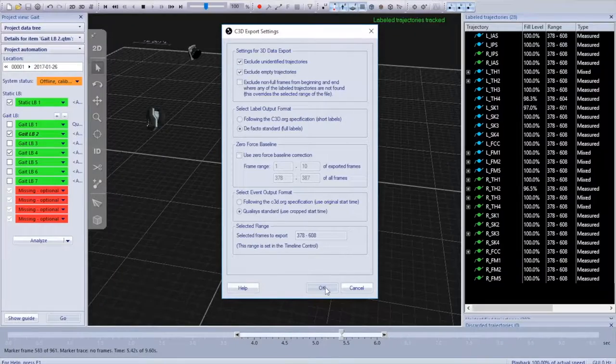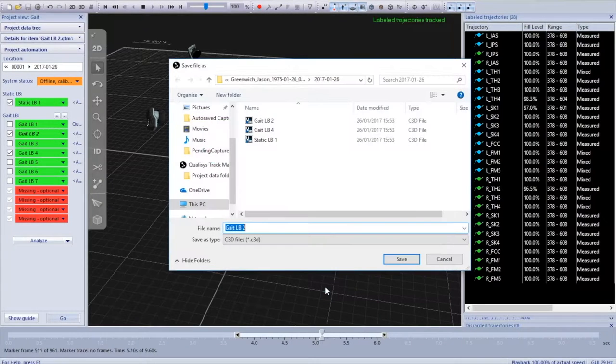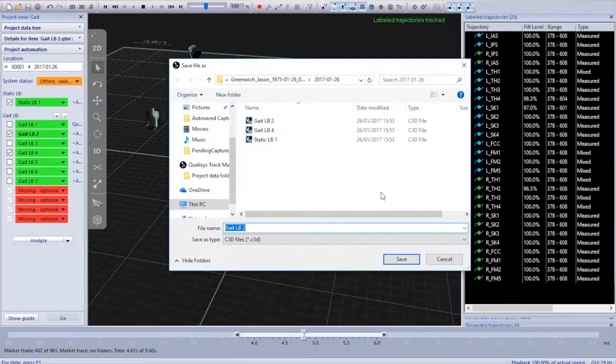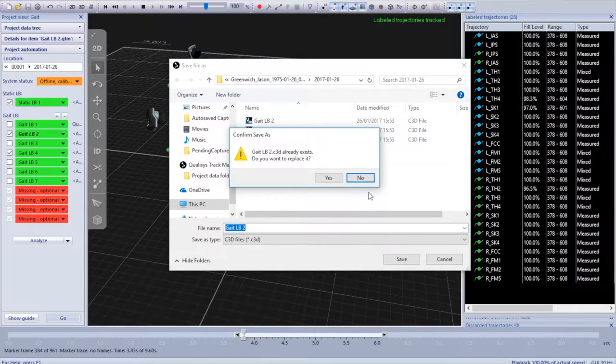So I'm going to click OK and just going to output gate LB2 as the C3D file.